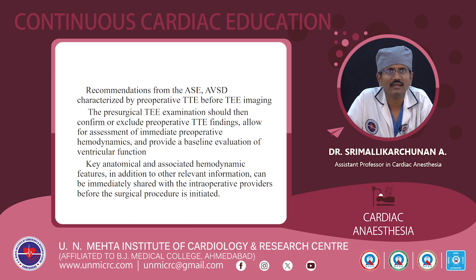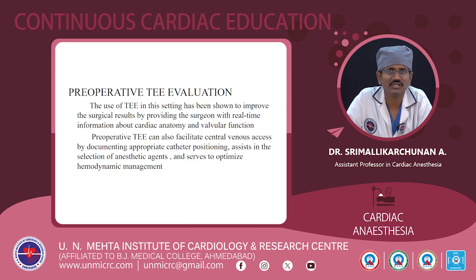The recommendations from the American Society of Echocardiography for the AVCD are that it is characterized by preoperative transthoracic echo before the transesophageal echo imaging. The pre-surgical transesophageal echo examination should then confirm or exclude the preoperative TTE findings, which allows for the assessment of immediate preoperative hemodynamics and provides a baseline evaluation of ventricular function. Key anatomical and associated hemodynamic features, in addition to other relevant information, can be immediately shared with the intraoperative providers before the surgical procedure is initiated.